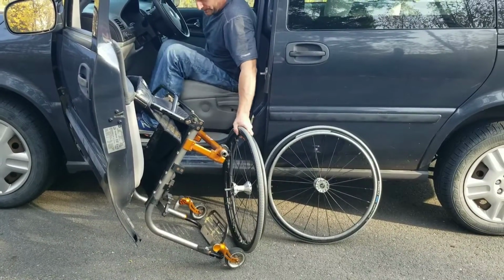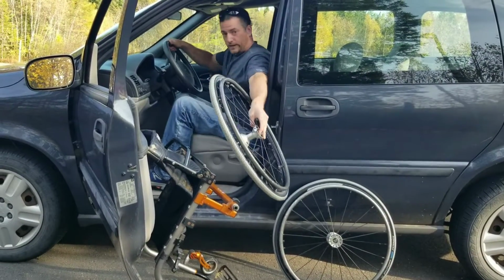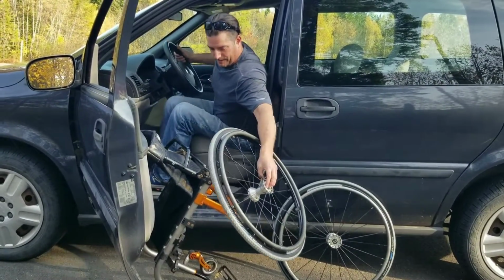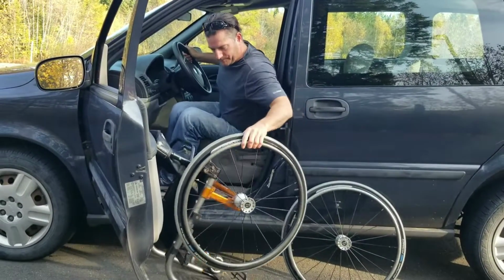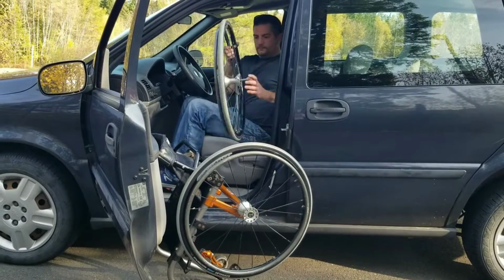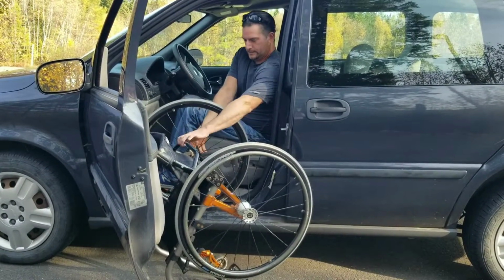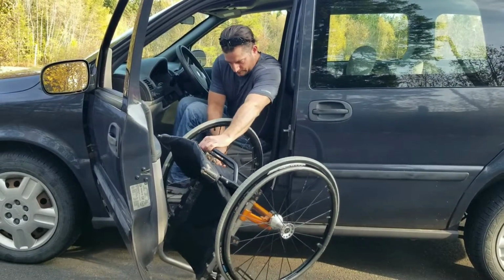So I'm going to shimmy out a little bit. There we go. Again, I'm going to grab something. I have some good balance, but not that good balance to go over. So I'm going to lean over, pop my wheel on that way. And then I have this other tire. I'm going to slide it on like that. Okay.